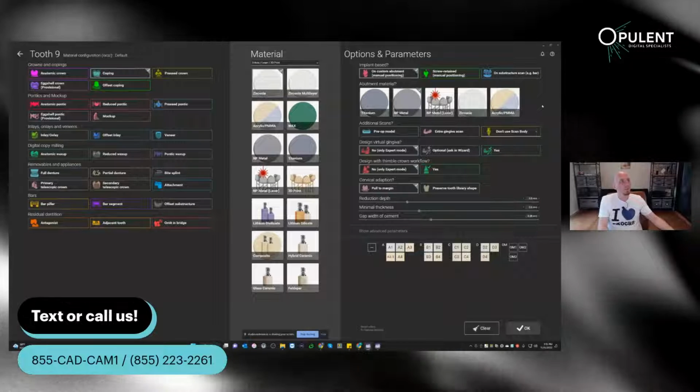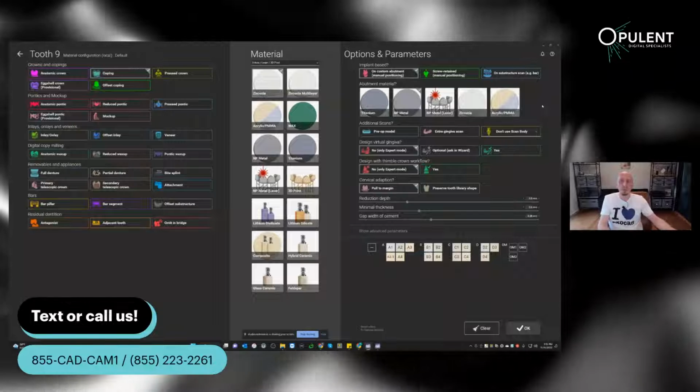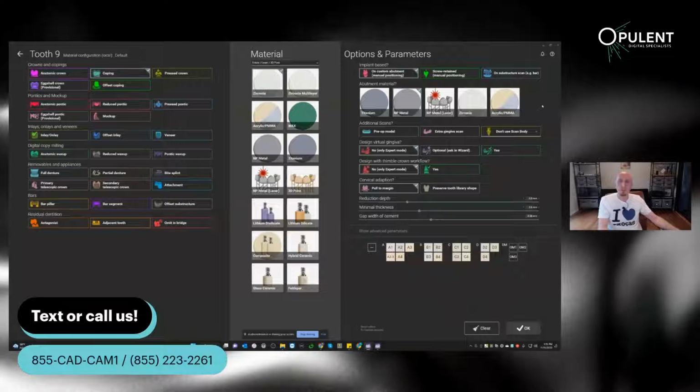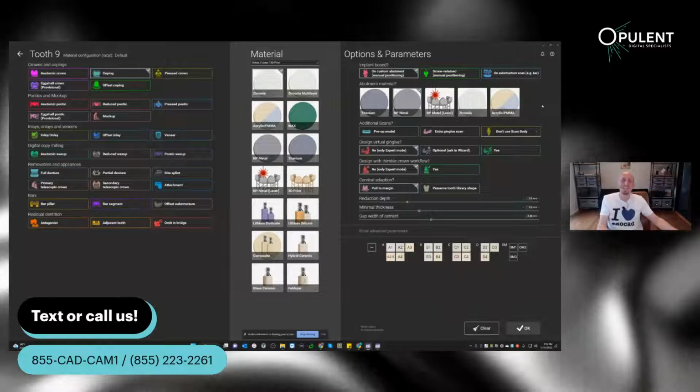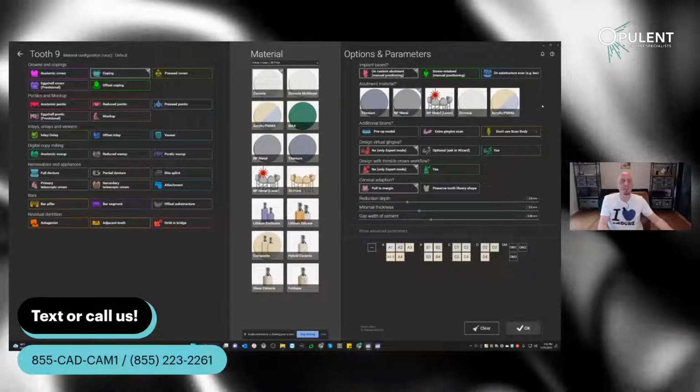So you might design your case, you might order the part from your rep, the part shows up, and then you're realizing, oops, somehow that part looks vastly different than what I had designed in my CAD. How did that happen?